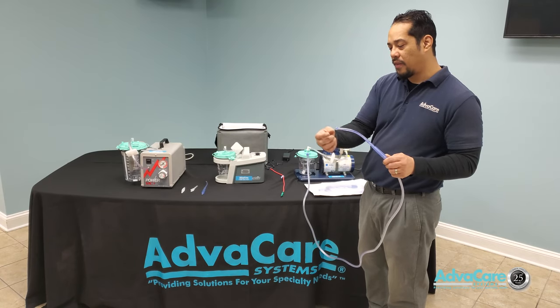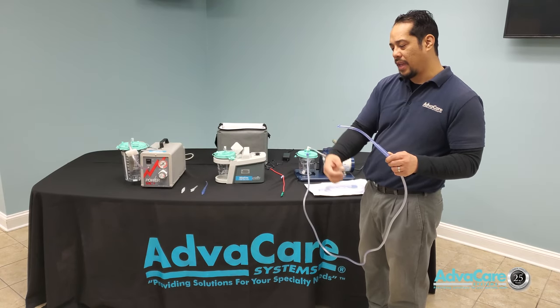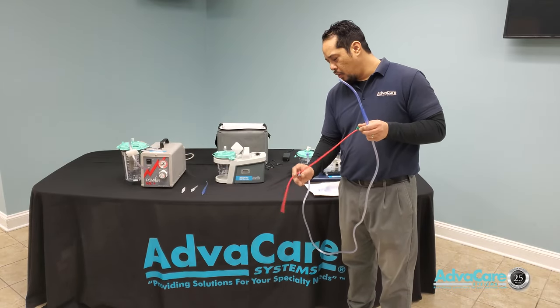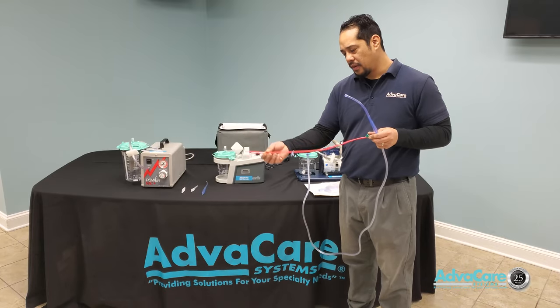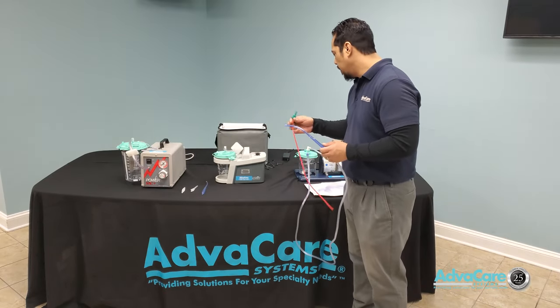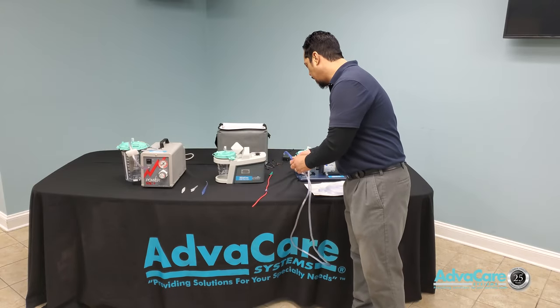Keep in mind, whenever making any type of connections, you always want to avoid touching the actual tip of the Yankauer or the portion of the catheter that will be entering into the patient's oral passage or upper respiratory area.